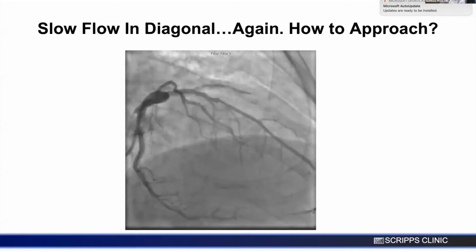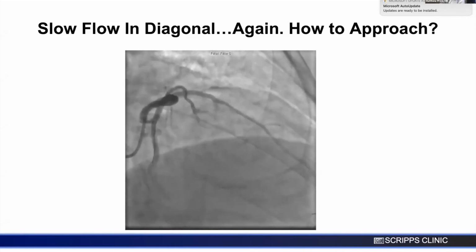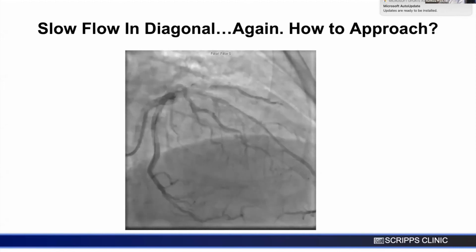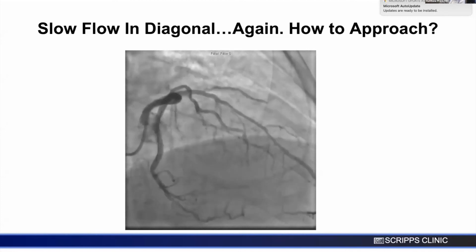Thoughts? No dinner tonight. Okay, so I see Raj is on the line here. Well, now this diagonal is forcing my hand. I'm thinking the diagonal is probably the main culprit here because there's TIMI 3 flow in the circumflex. That'll have to be addressed. I think I have to go back, and the diagonal needs more attention. I need to put a stent in there.